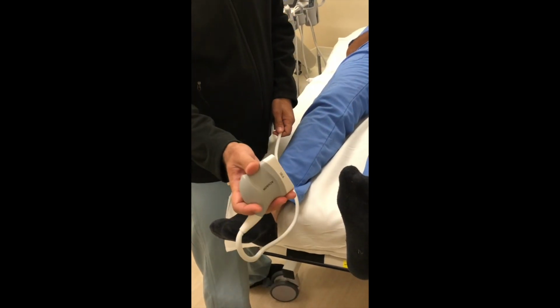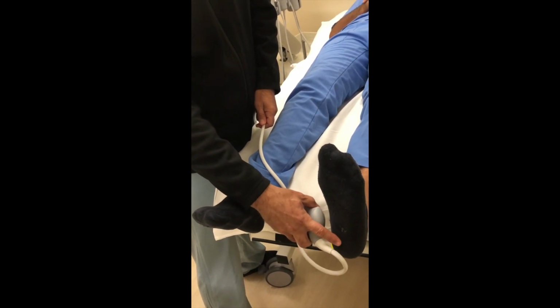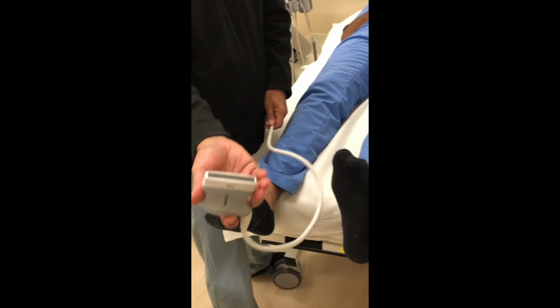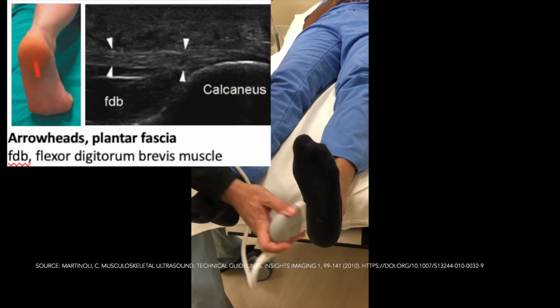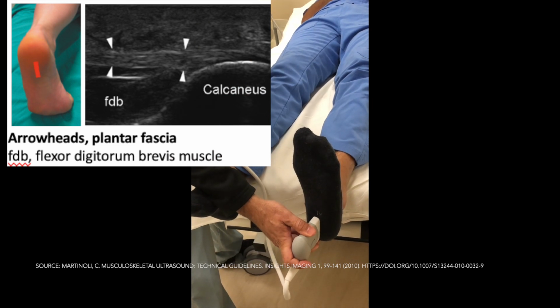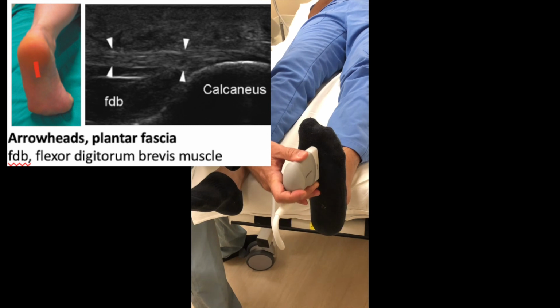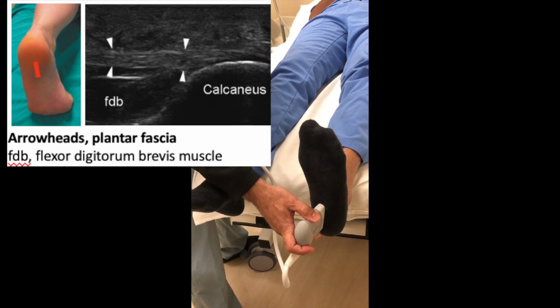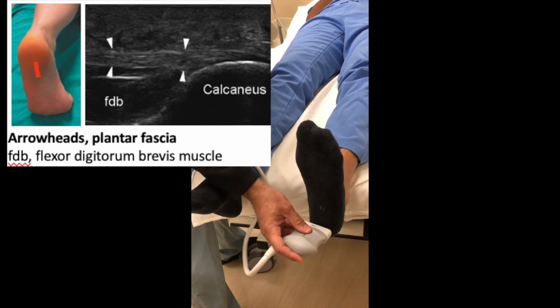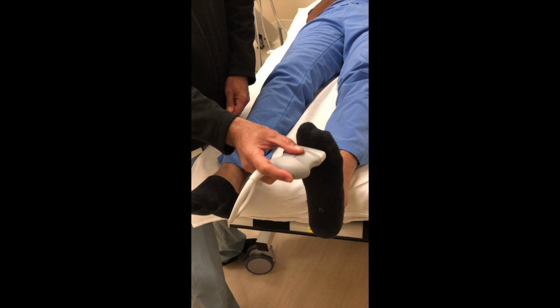Lastly, we evaluate the plantar aspect of the heel, looking for any tears or inflammation of the plantar fascia. We use a long footprint linear transducer, an 18. We will place it along the plantar aspect of the foot, starting at the calcaneus and working in a long axis view towards the tip of the toes, interrogating the plantar fascia for tears, inflammation, or masses. Then we will also evaluate it in short axis all the way to its distal insertion.